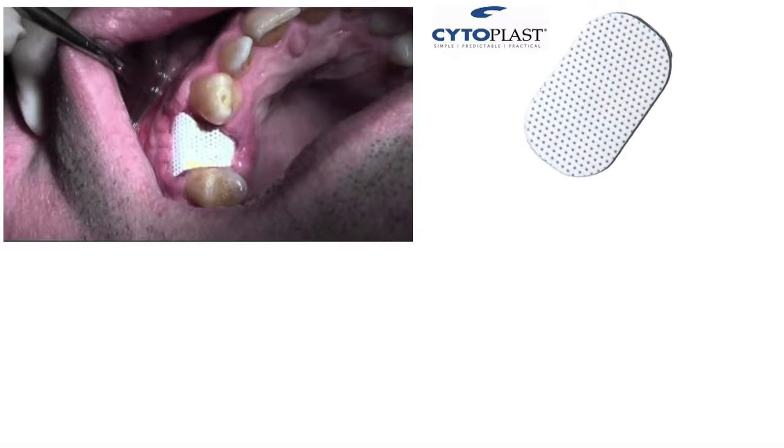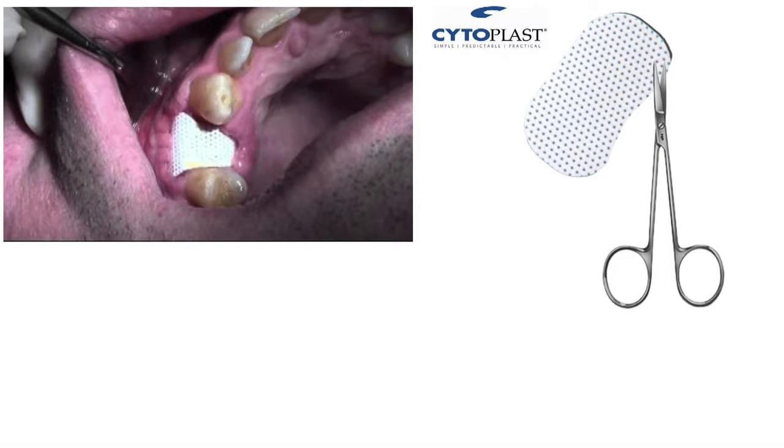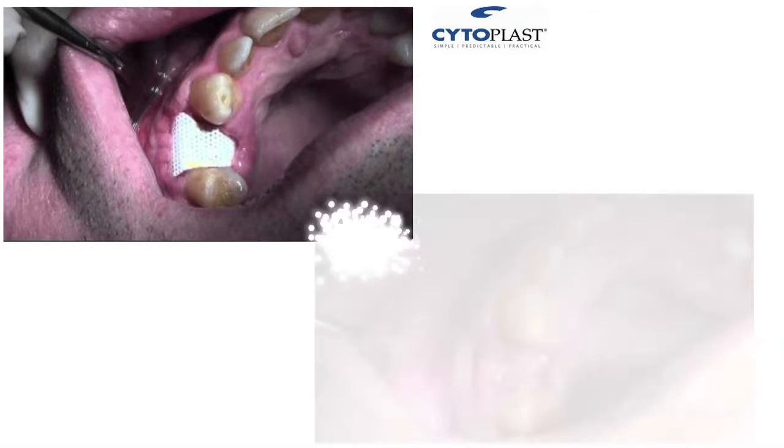Again, here's an example of the PTFE in place. And this is what it would look like if you were to trim it, to make sure it's an hourglass shape and it goes around. In the example I gave, I didn't have to do it because the socket space was wide enough. And it goes in place here. And at about 4 weeks, that's what it looks like. It doesn't look very pretty, but it works. All right.